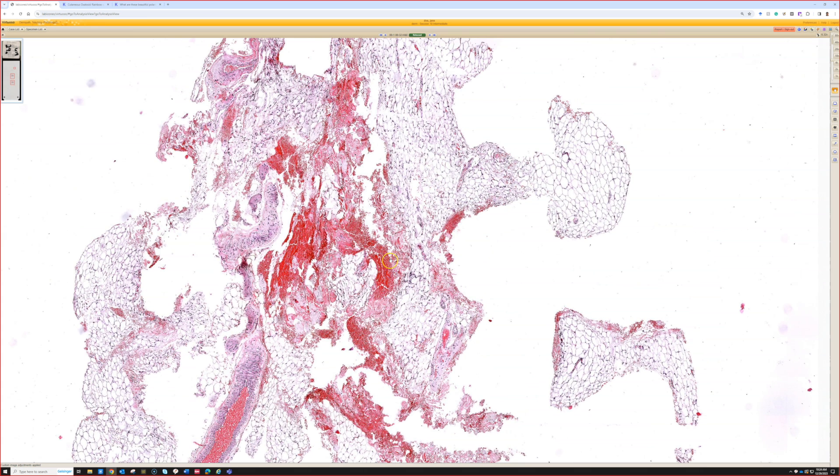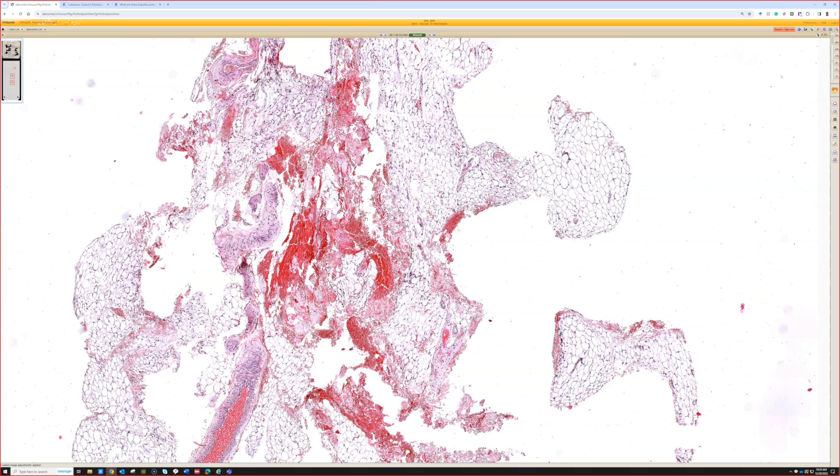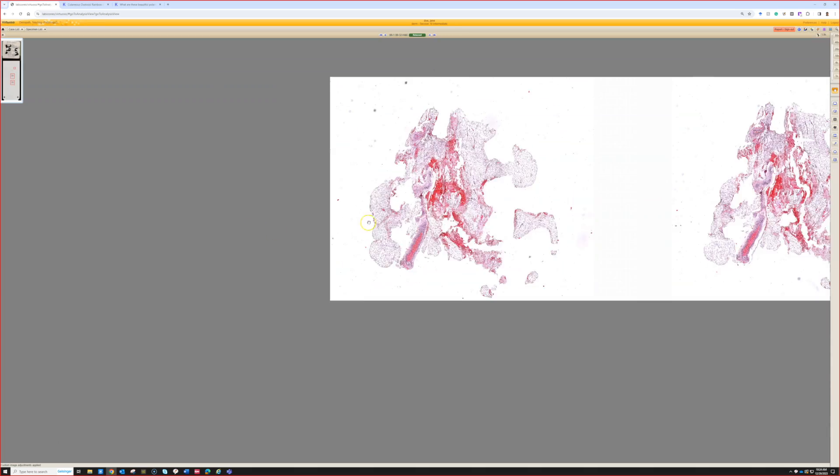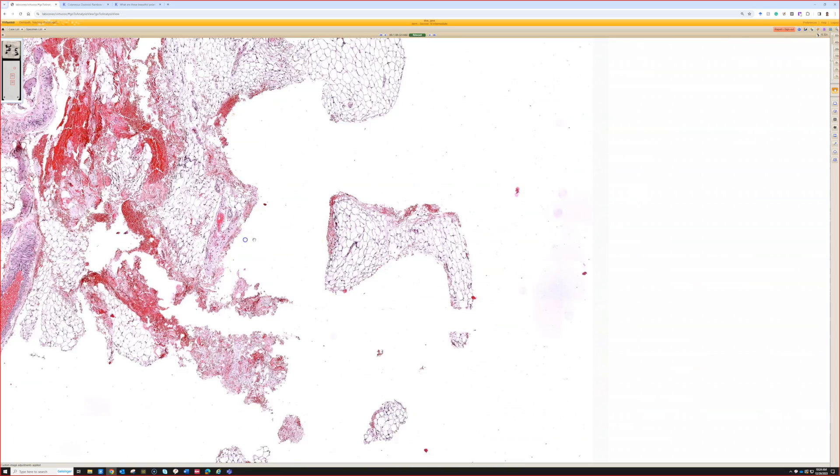Ideally you want to see the subcutaneous fat and you want to see some thick-walled vessels, and the more of that you have, the better your chances are of making sure you find amyloid if it's there. So if there's only a tiny chunk of fat, I may not see any amyloid, but I'm not sure it's not a false negative.